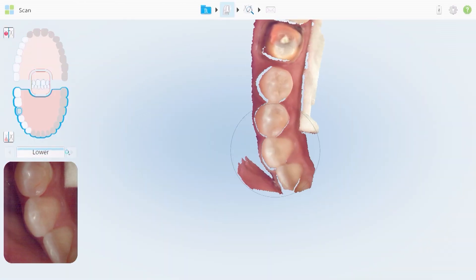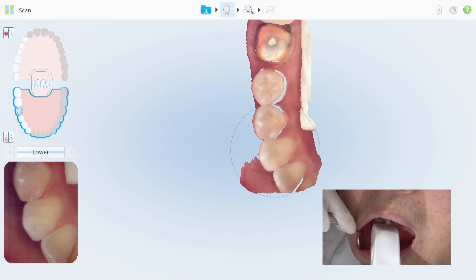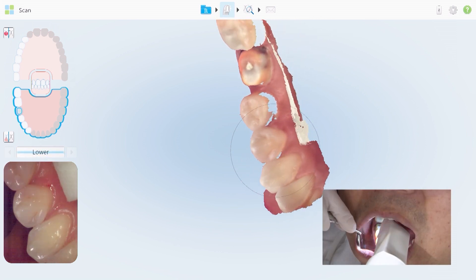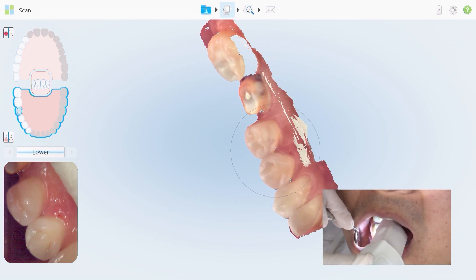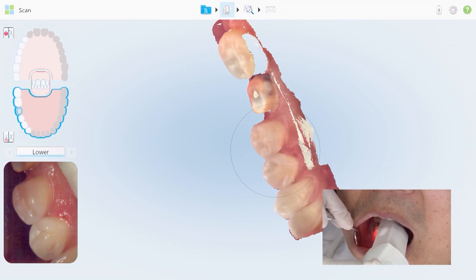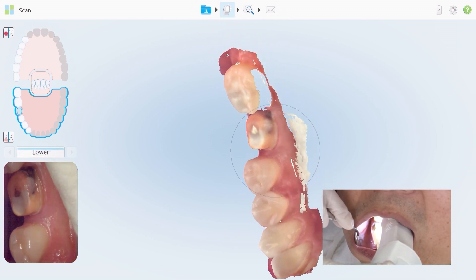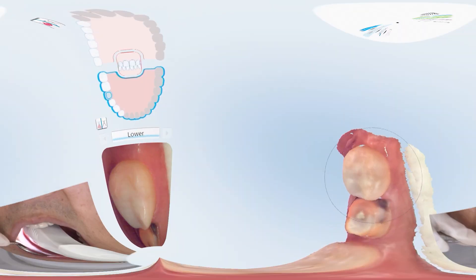Once I reach the canine tooth number 27, I'll rotate to the lingual. Now we'll capture the lingual surfaces of the adjacent teeth first in this case, and then begin working my way back to the last tooth.